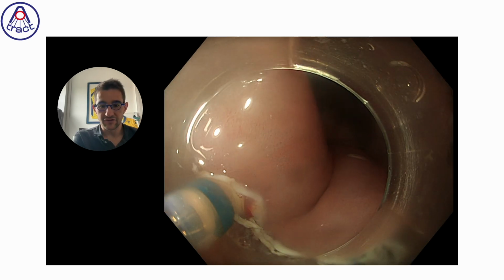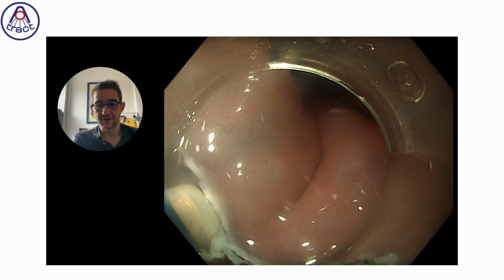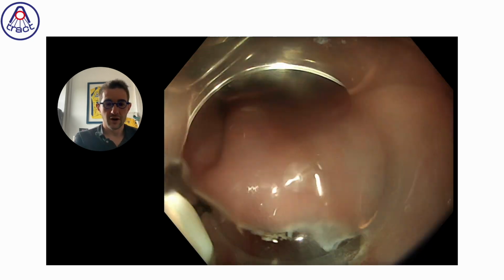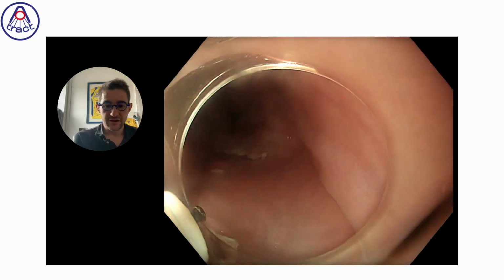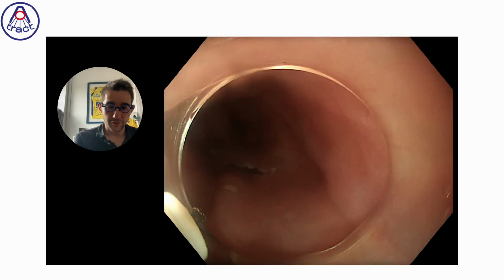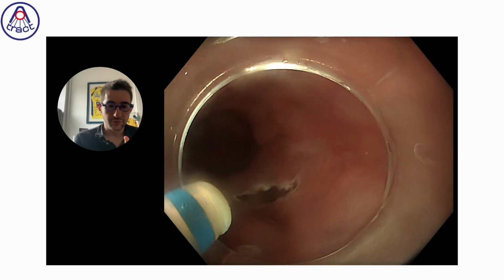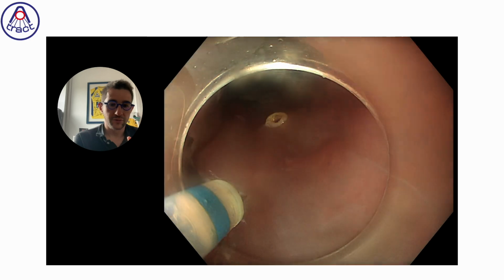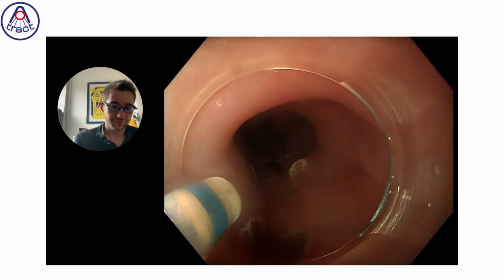Gravity is on the left, so I usually prefer to begin by the left, because if I begin by the right side, it will fall on the left and become more difficult. But in an easy case like this, everything is possible. But it's a little more logical to begin by the difficult side. I do small dots to be sure I will have the margins.